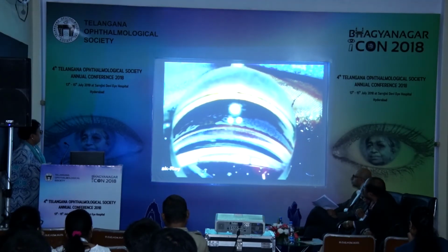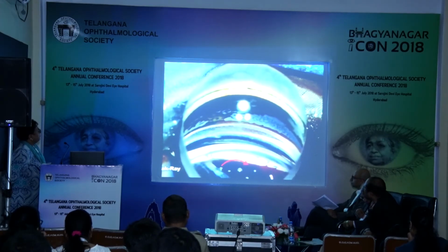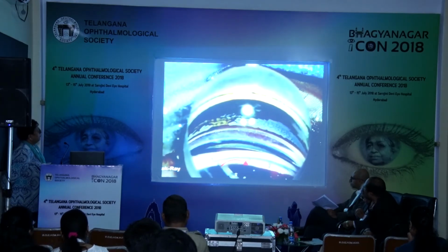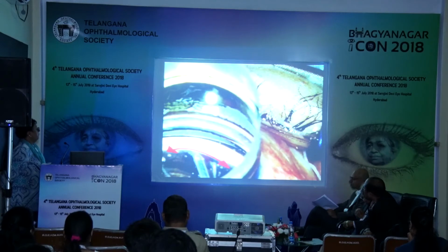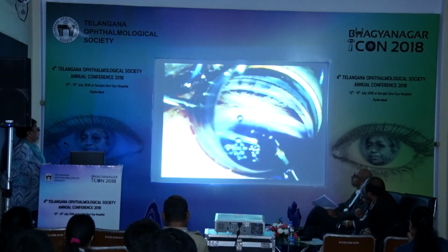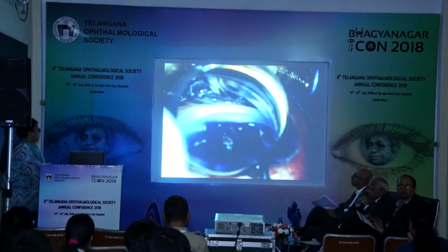Excised trabecular meshwork strips are detached from surrounding tissue by converging cuts into the trabecular meshwork from opposite directions. A minimum of 3 to 4 clock hours of trabecular meshwork in aggregate is excised, about 90 to 120 degrees. Irrigation aspiration is used to remove the already free-floating trabecular meshwork strips.